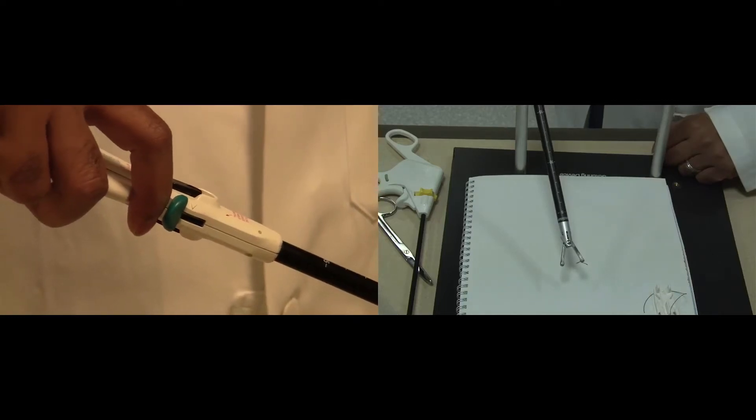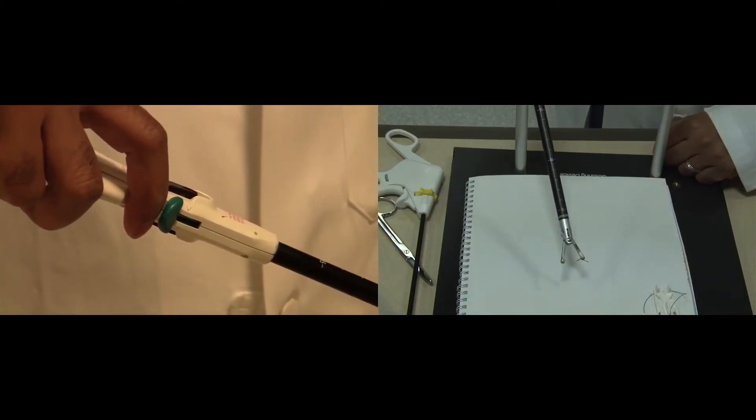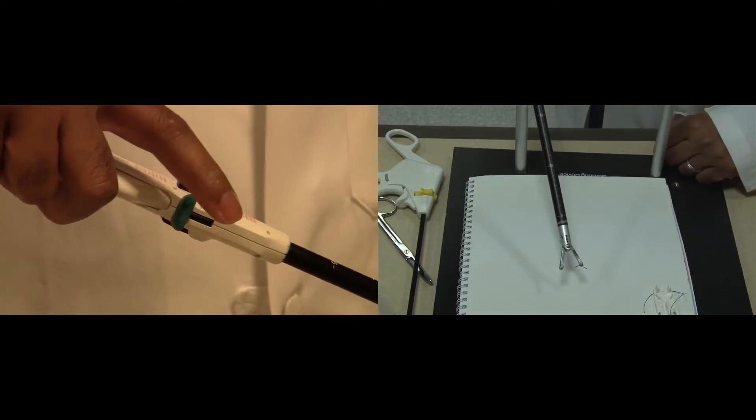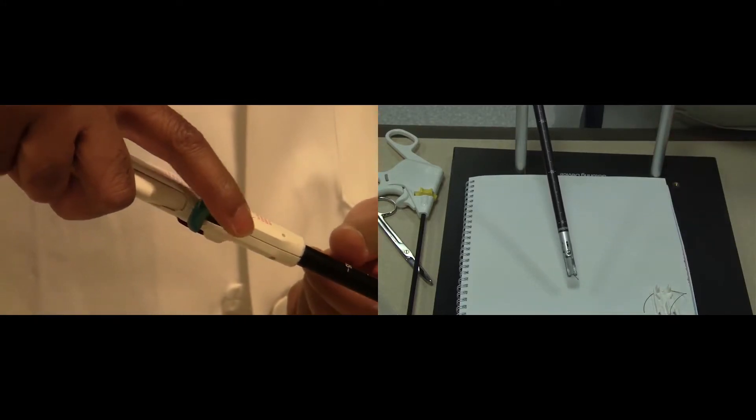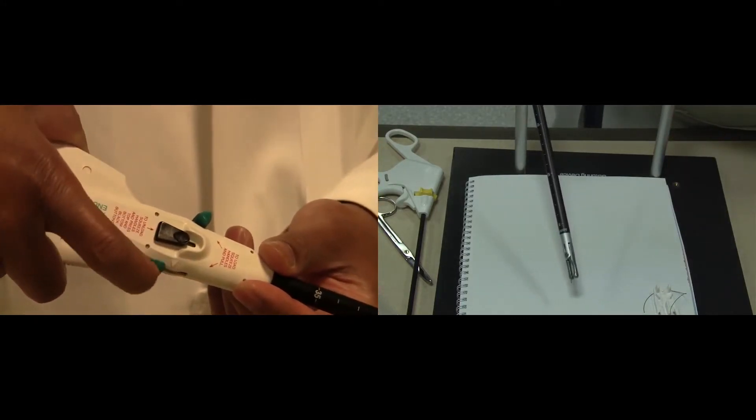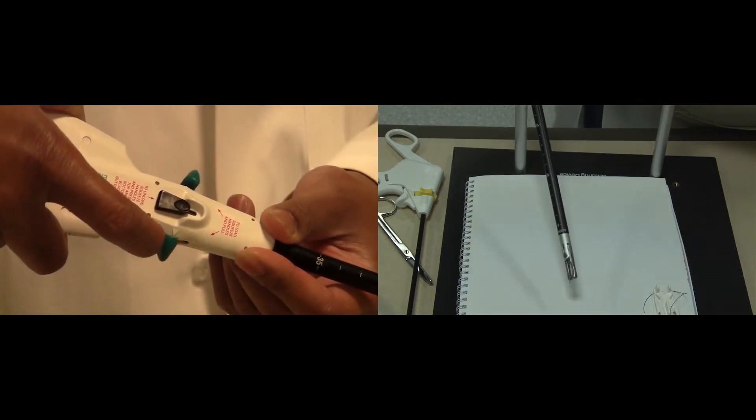This is a demonstration on how to change the needle on the endostitch suturing device. First, close the device by squeezing the two handles, and then manipulate the green levers so that they're in the closed position, which is in the middle.